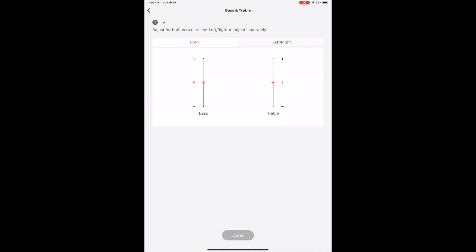But here's where it gets interesting. When you try to press the bass and treble, you have the capability of doing adjustments for either both or you can do them individually for each left or right. Now here's the first thing I would say that really kind of drives me nuts about this. There's really only three different settings that you can use.